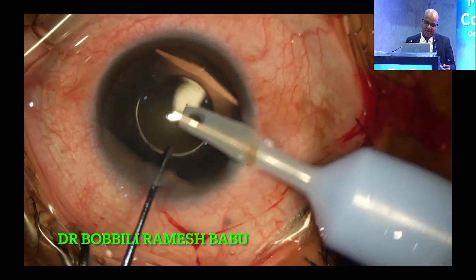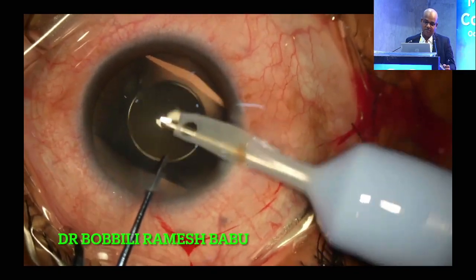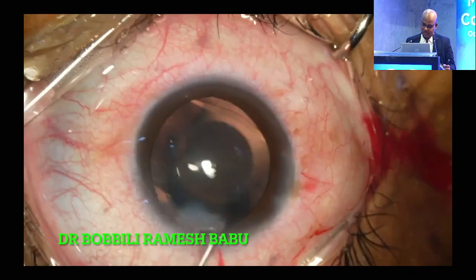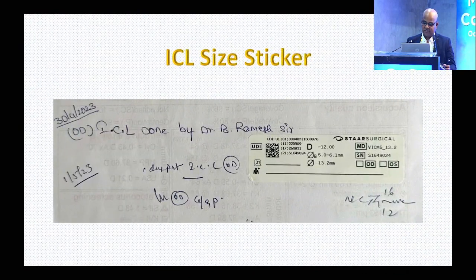I have the habit of first irrigating behind the ICL through the central hole. Then afterwards, I will be putting the aspiration port near the central hole. This is the surgery. It was done. So this was the sticker.